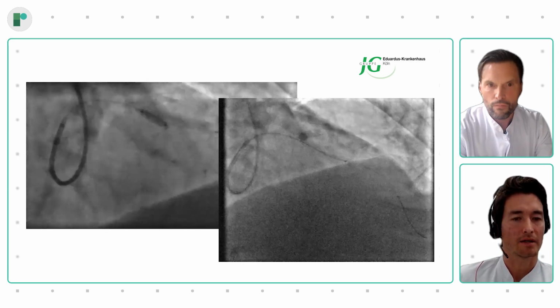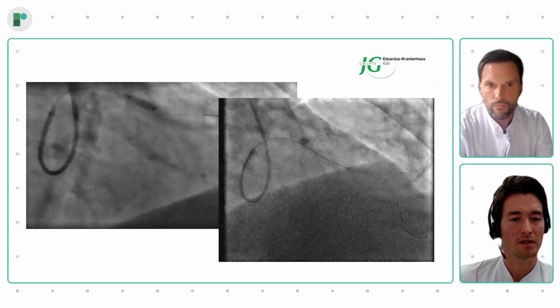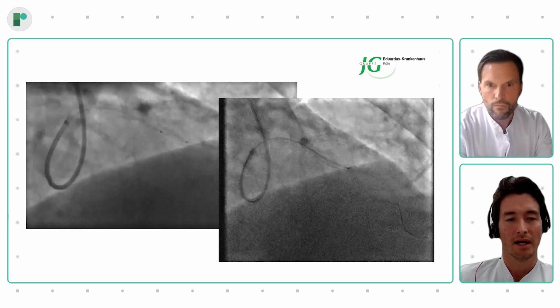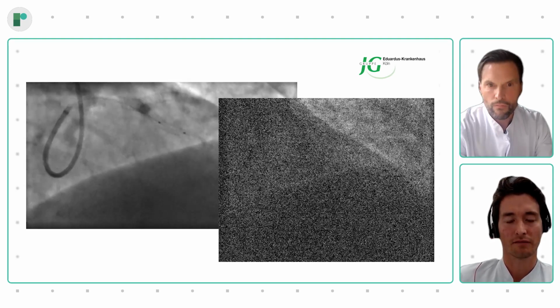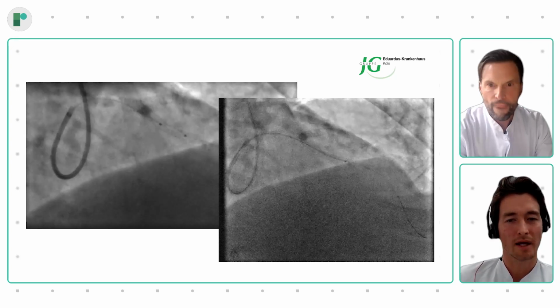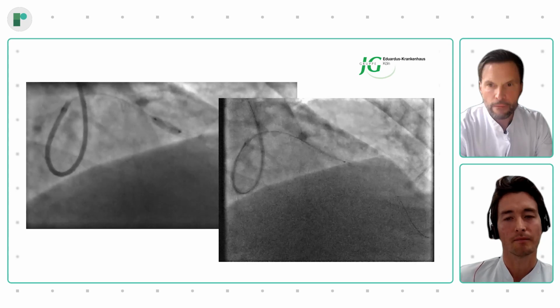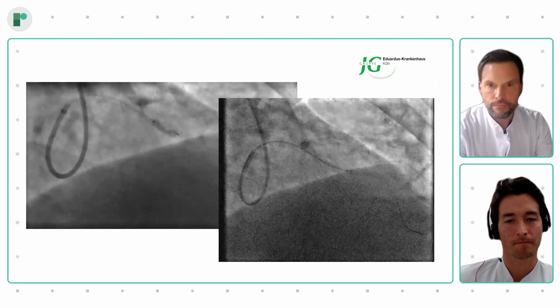3.0 by 8 millimeters. And as you can see on the left-hand side, the balloon gets dislocated proximally. There's some dog boning that you can appreciate. And honestly, in this patient at 50 years old, with really no native sclerosis, I wouldn't have foreseen this behavior of the balloon. And then we proceeded with HD IVUS. You can see the probe here, which is introduced.